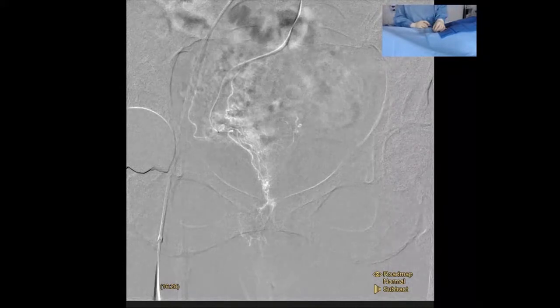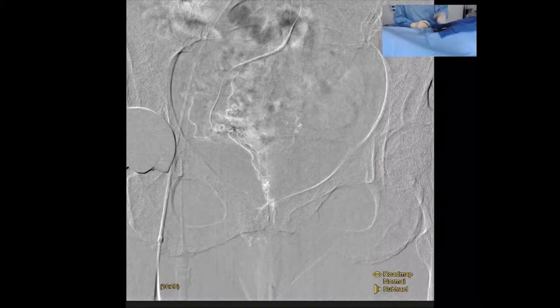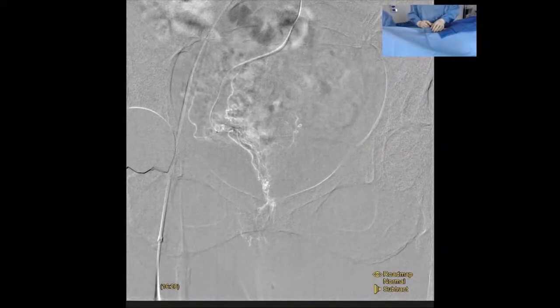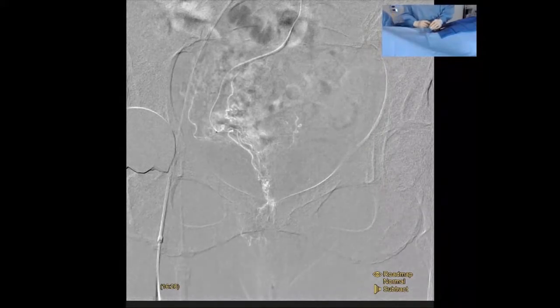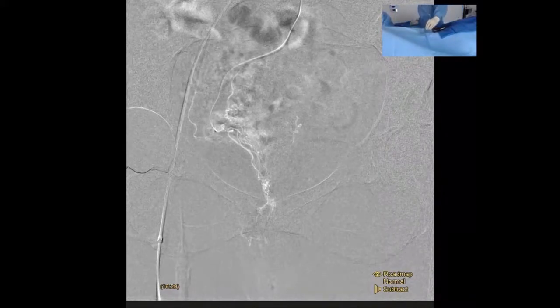In here, we're using 300 to 500 size. Typically, we'll use even a size a little bit larger. 500 to 700. Somewhere around 600 seems to be an ideal size. Our challenge in her actually is that the reason the size works out well is because of the size of her smaller vessels. So it's really not a one size fits all. Personalized medicine. So after we've got that through, there you go.